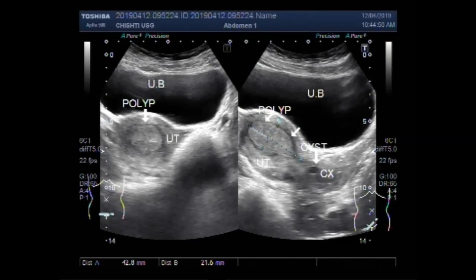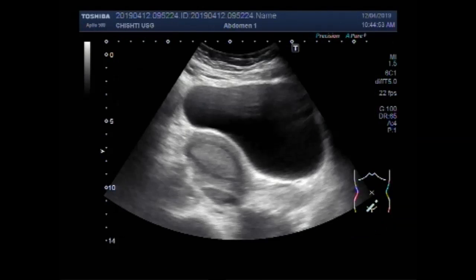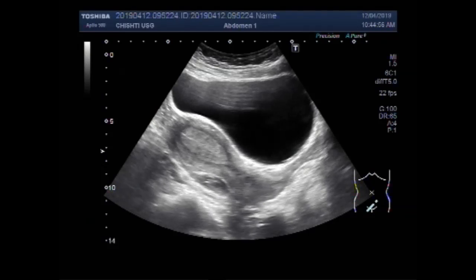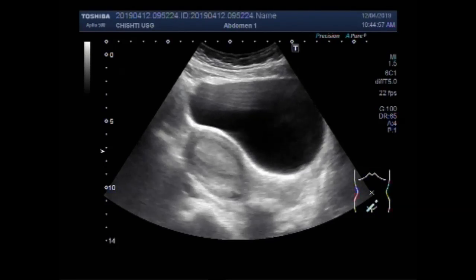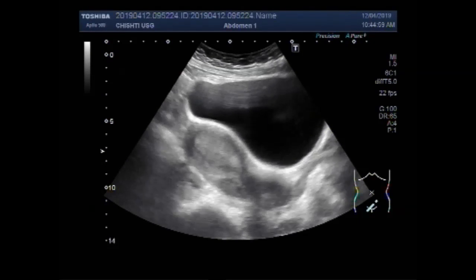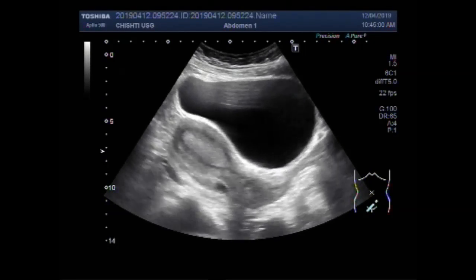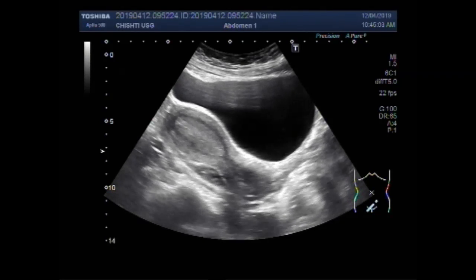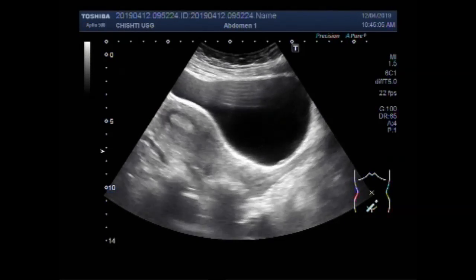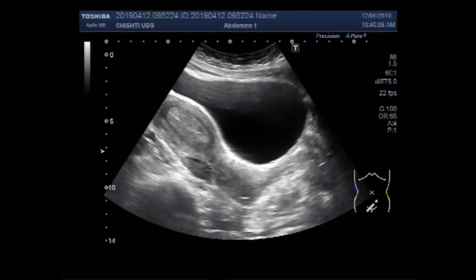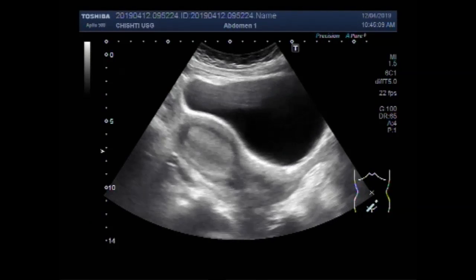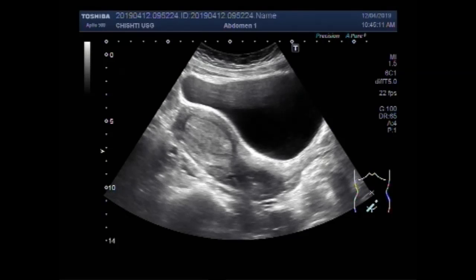Dear viewers, I hope you are all fine. This ultrasound video will show two cases of polyp in the uterus. Now you can see the uterus, urinary bladder, and a polyp in the distal portion of the uterine cavity.